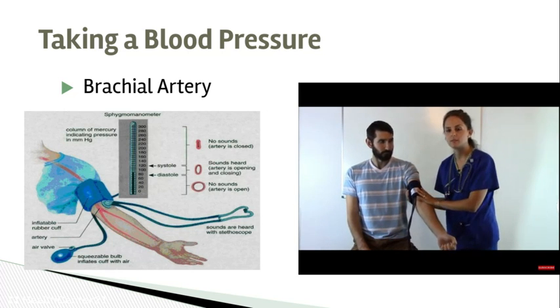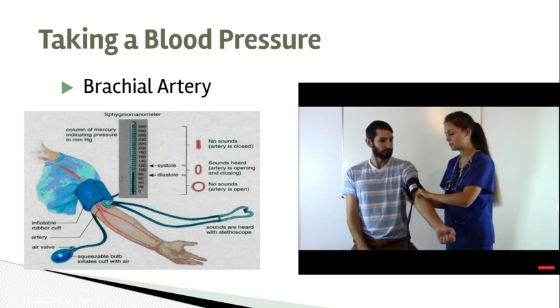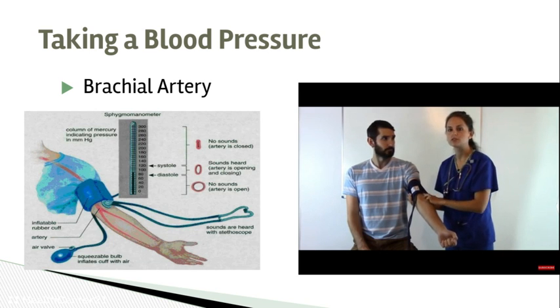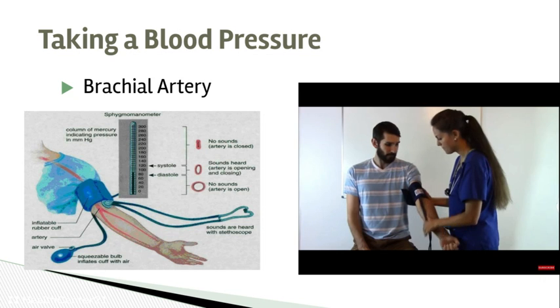And you always want to make sure that your cuff fits the patient. You have really small patients, and then you have some obese patients who would need larger or smaller cuffs. To check your cuff size, use 2 of your fingers and just slide it underneath the cuff. Make sure it fits good, not too snug, not too loose, because if you have a blood pressure cuff that does not fit, you will get an inaccurate reading. And this cuff fits him great.